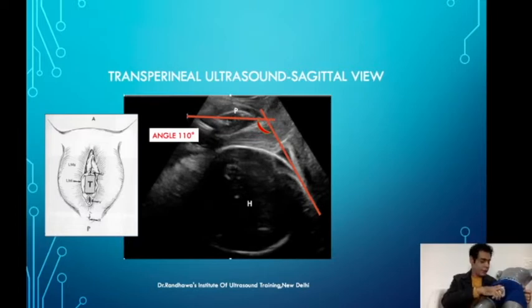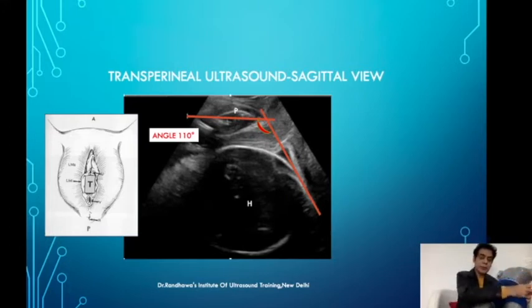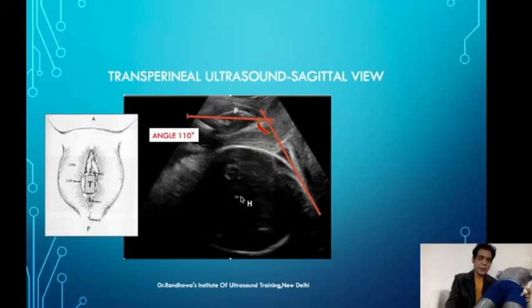Since the pubic symphysis is just beneath the superior part of the probe, it will be displayed on the monitor in the superior portion. As you know, this side is the superiormost and this is the inferiormost. So the pubic symphysis will start somewhere from the superior part and end here. The head will be posterior to the pubic symphysis — up is anterior and down is posterior — so posterior to the pubic symphysis you will see the head.